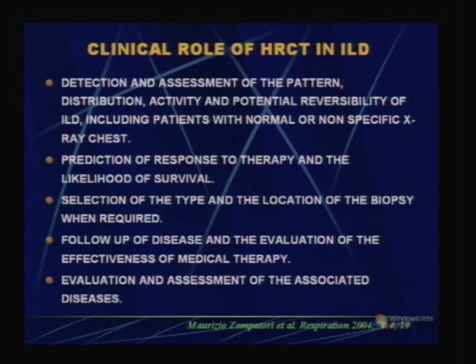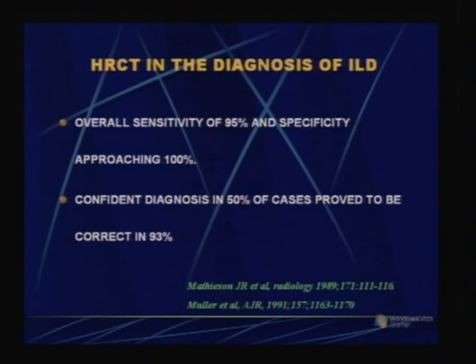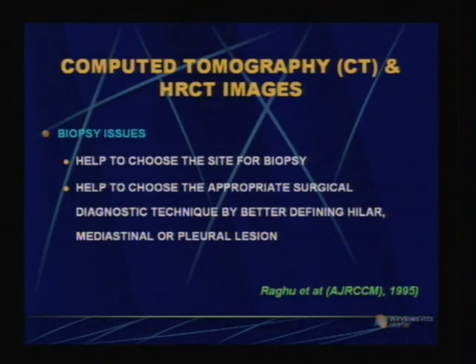And in some cases, by looking into the HRCT picture, we can also anticipate the response to therapy, whether this patient is going to respond to anti-inflammatory drugs or not. It can also help us in choosing the right site for histopathology.